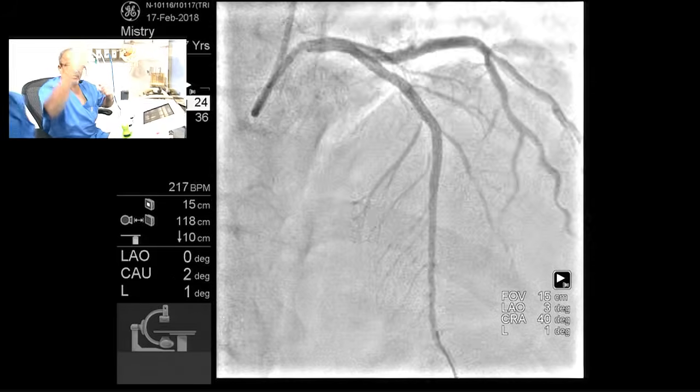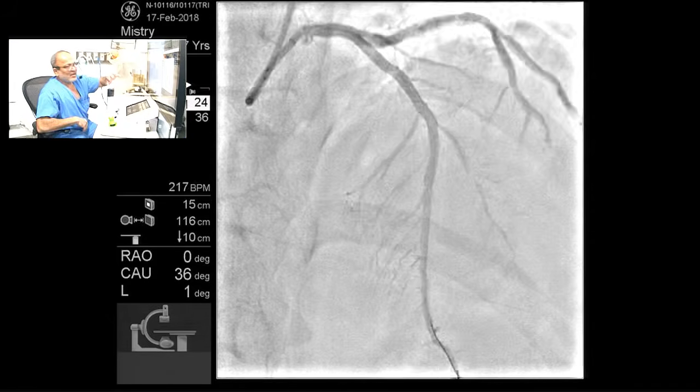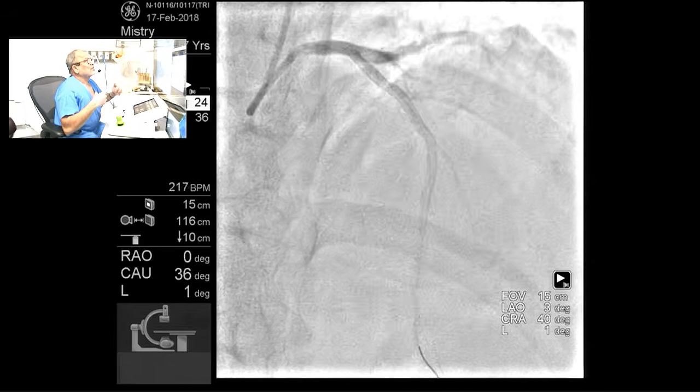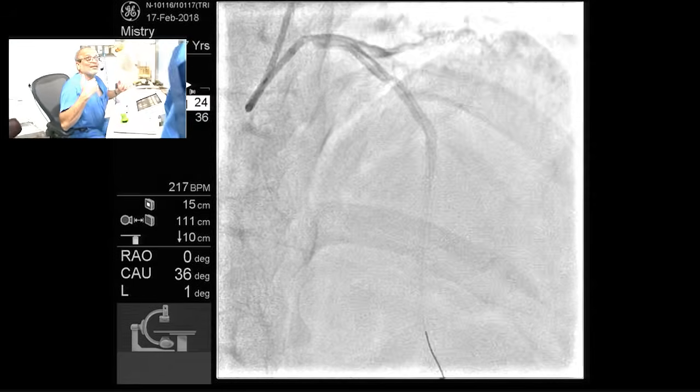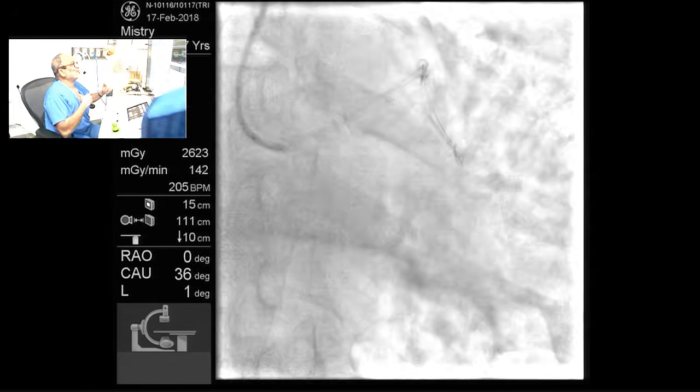Sanjay, you can scrub there and make Mauricio scrub. Meanwhile, I will continue with a couple of minutes discussion here. Can we move the guiding catheter, guiding wire, separately? Yeah. I'll show you that. I want to show you that.